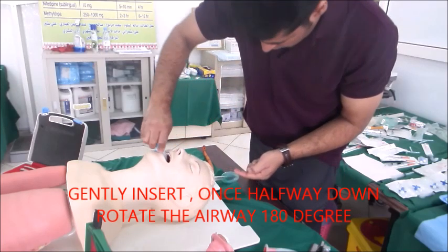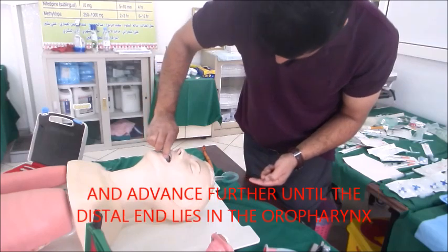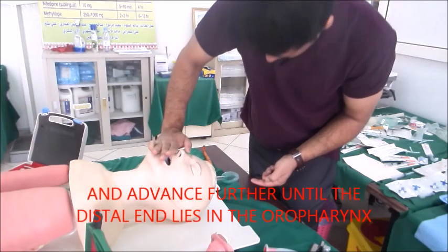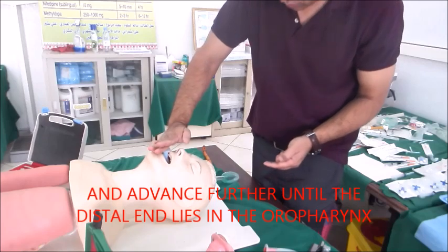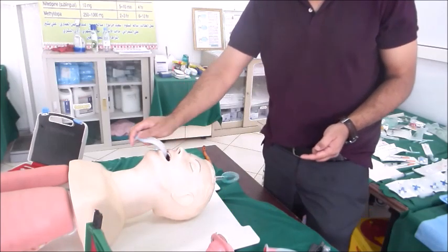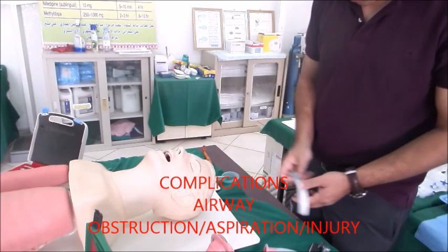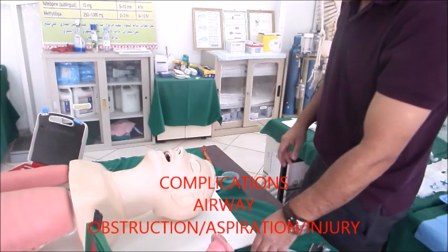Once halfway down, rotate the airway 180 degrees, then advance further until the distal end lies in the oropharynx. This is the correct way to insert an oropharyngeal airway. Complications include airway obstruction, aspiration, and injury.